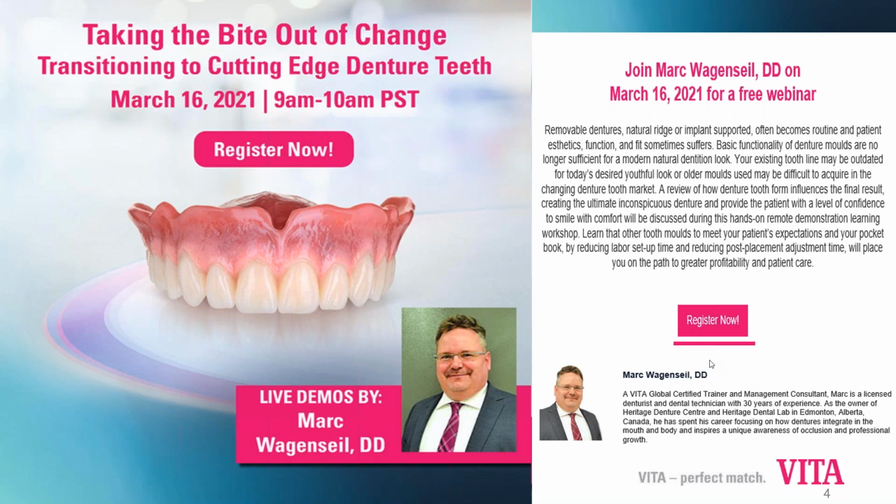Whereas in acrylic, the abrasiveness will stay and get worse, and it actually wears it down. Whereas because of the glass, when you wear it against each other, it starts to polish itself. So that's why, hence self-polishing. So it's almost like a wear-resistant ceramic material, because it has a large percent, 14% of a ceramic filler. So that's good.